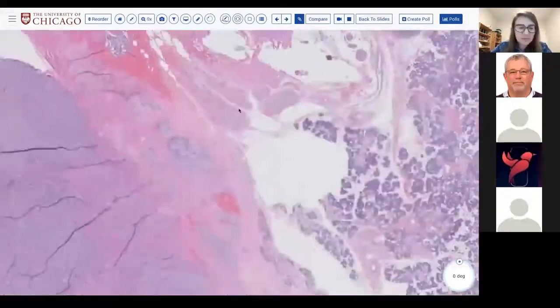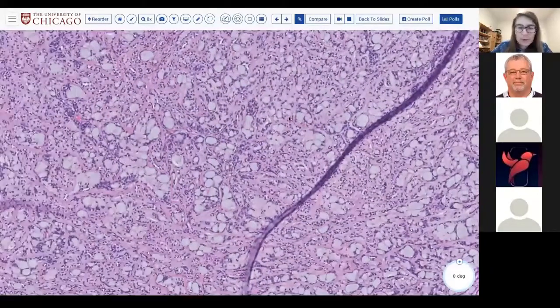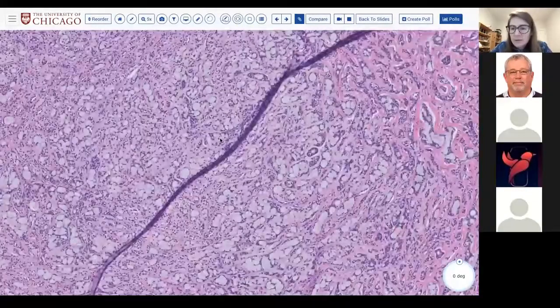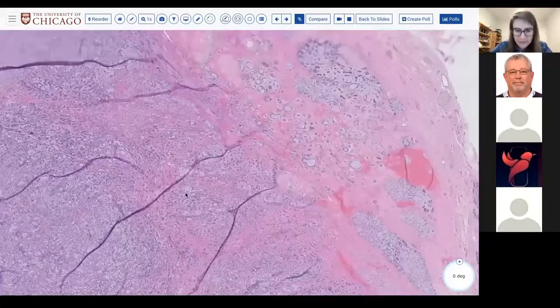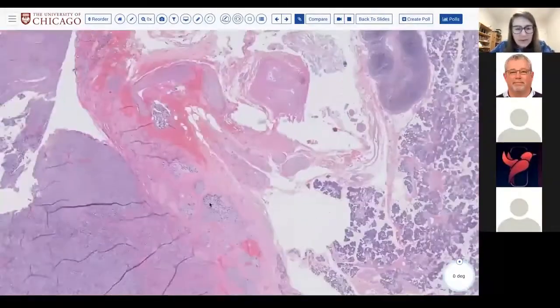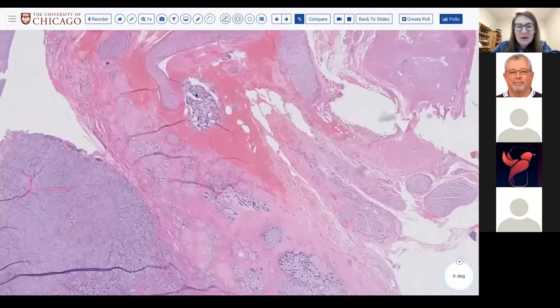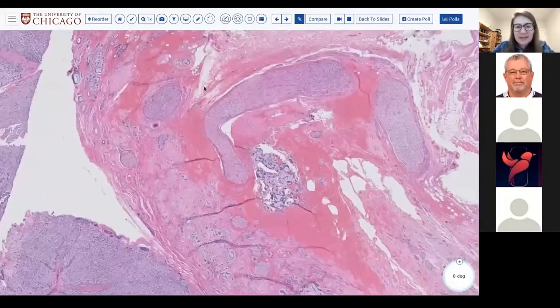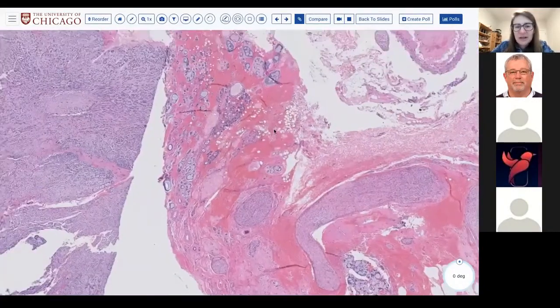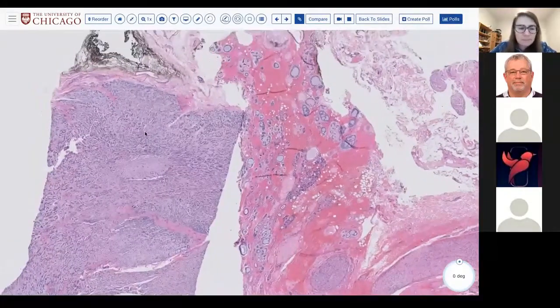And this is the resection, which in fact shows much more characteristic cribriforming, and you can see at the periphery, excuse me, and oops, my mouse is going the wrong way, an infiltrative growth pattern here, sending these nests way out into the periphery next to these large nerves. So yes, in fact, adenoid cystic is the correct answer here.